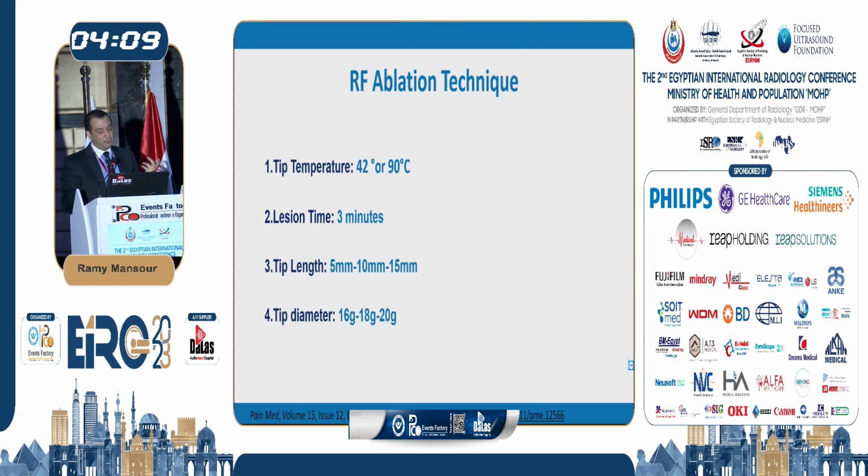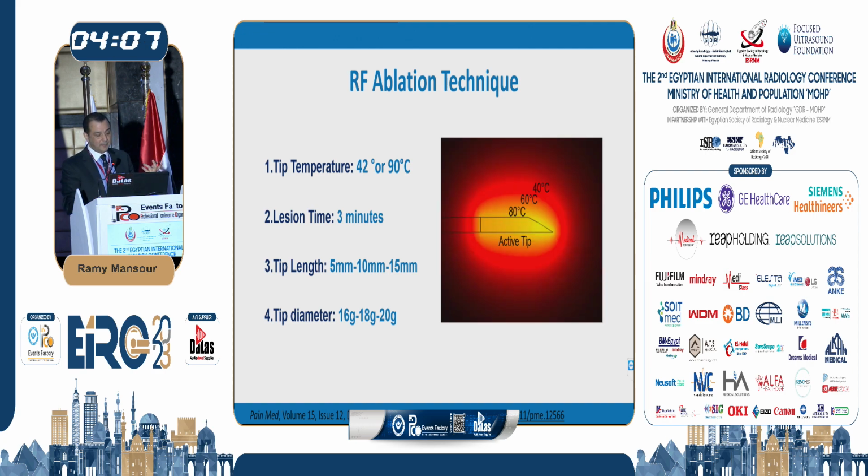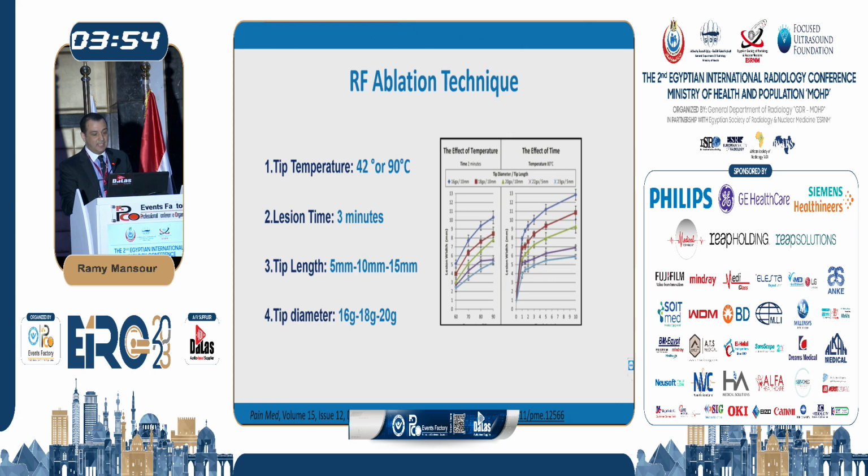And why is this important? Because this is how the distribution of heat is. So if your target area or nerve is away in the 40 degrees, you're causing less damage to the nerve.